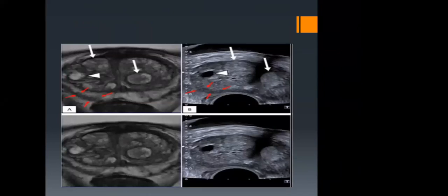Some of the abscesses previously, you know, technology is advancing. At the start, MRI would not, or if you do a pelvic CT scan and you're unable to discern, is this a solid mass? Are these two the same because they have the same density? They have the same density, so you may not discern this. Even at times when CT applies the Hounsfield units, it gives you close to the same value. But nowadays, the new MRIs are advanced. They can clearly differentiate a cyst from a solid mass.